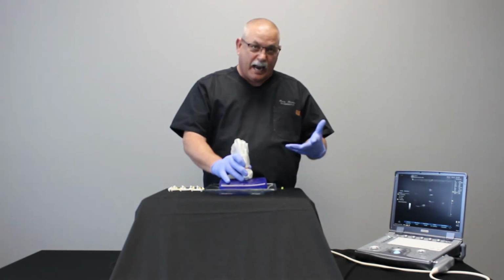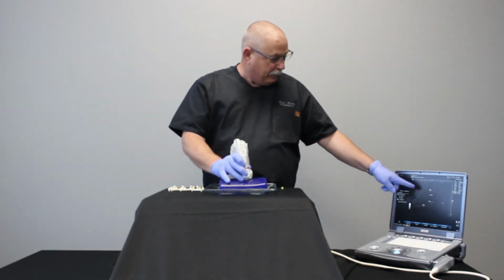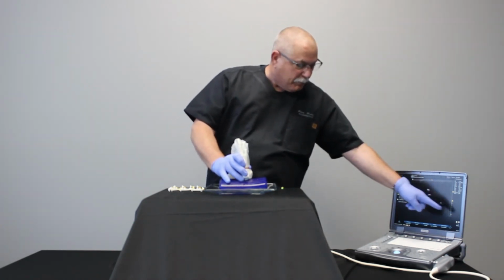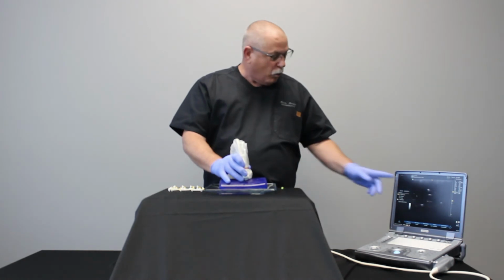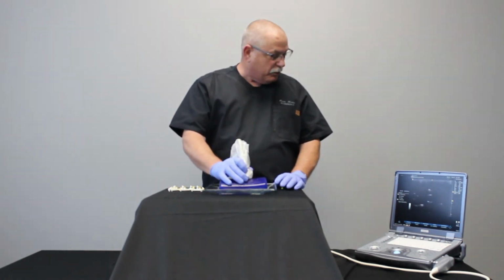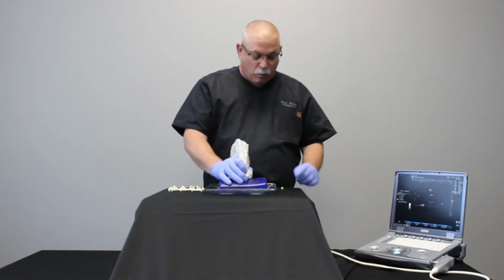Now, some systems have software that will actually put a center line on here, which is what I've done today. And each one of these is at 5 millimeters. You also have depth markers over on the side of your image. Or you can actually do a physical measurement to check the depth. But when using the AccuSITE Guide, we need to know how deep we're going. So this is at 1 centimeter.